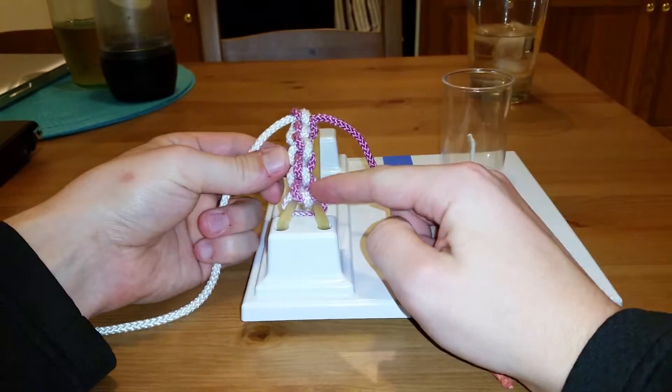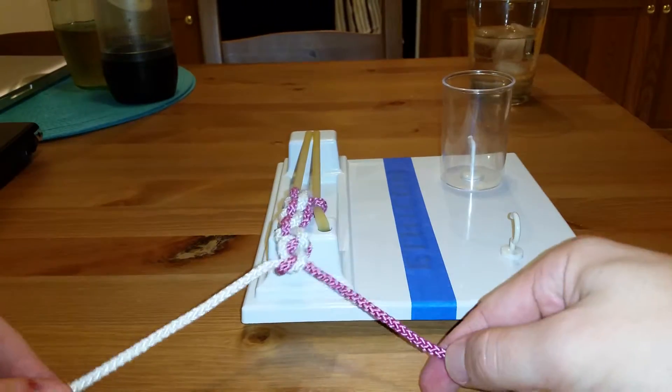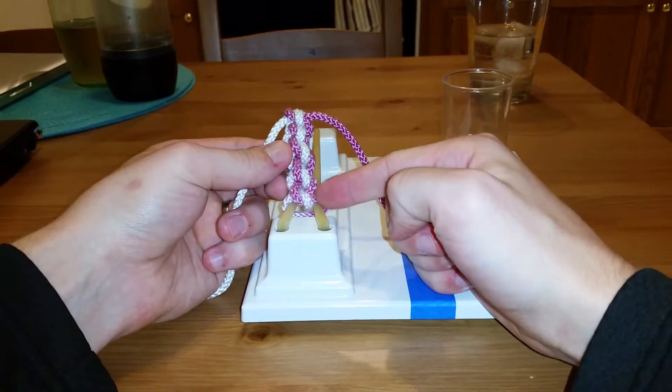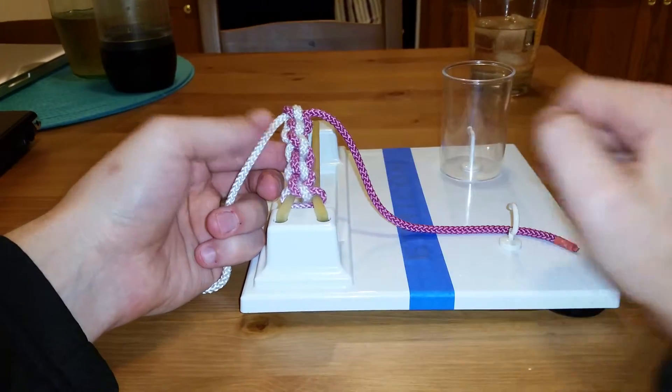You can see as you look at this stack here, you have parallel segments — five nice square surgeon's knots making a nice little column. This is what you should see if you're throwing the correct surgeon's knot. You should see them stack — you should see parallel whites and parallel purples.